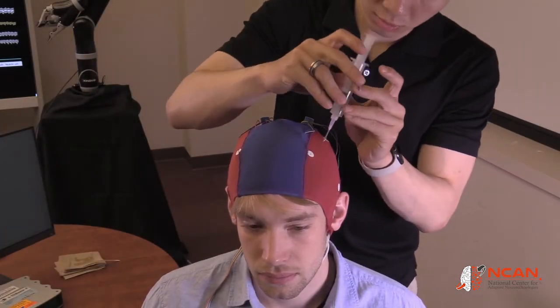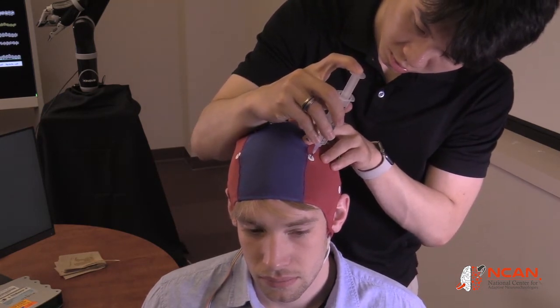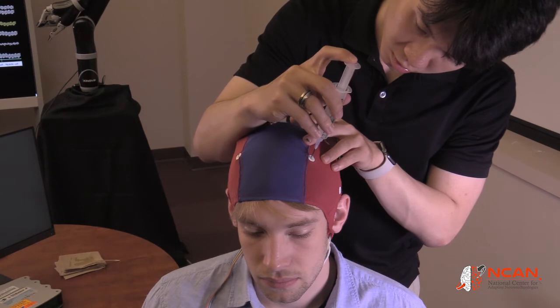We then reapply gel to those electrodes with impedance above 30 kiloohms. Sometimes it takes several rounds of this procedure to achieve a low impedance value.